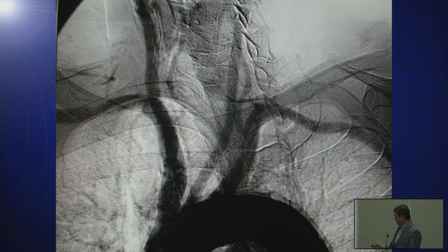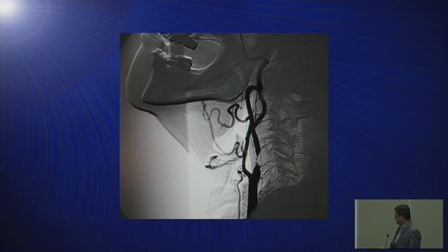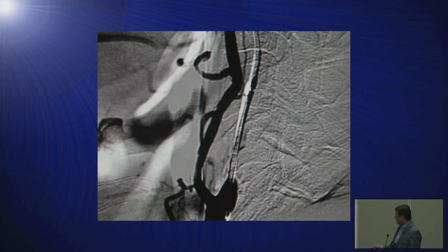We're going to go in via angiogram, and we're going to go into the right carotid and look at the artery. And so this is actually her lesion. And so we go ahead and place a wire past the lesion. That wire has a little basket on that. I'll show you that in a moment. And then we can place the stent in that area.